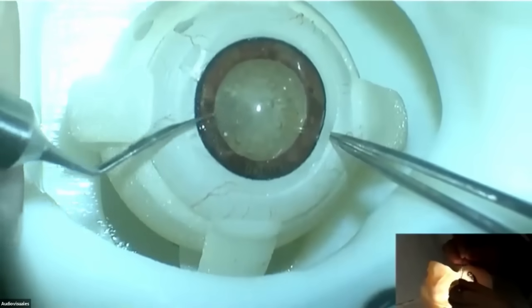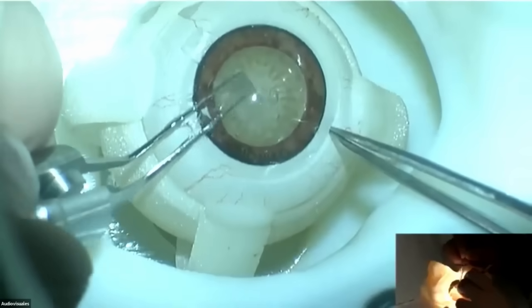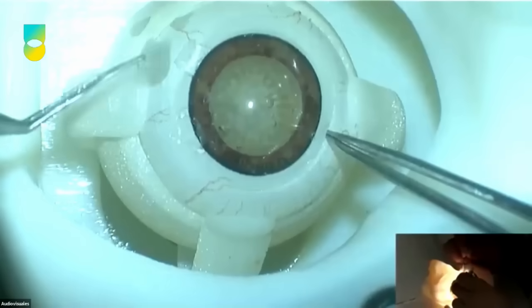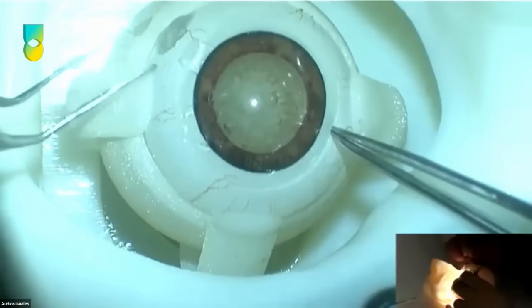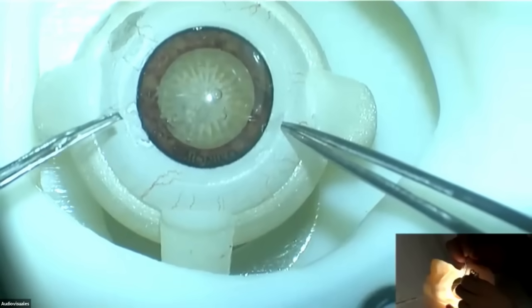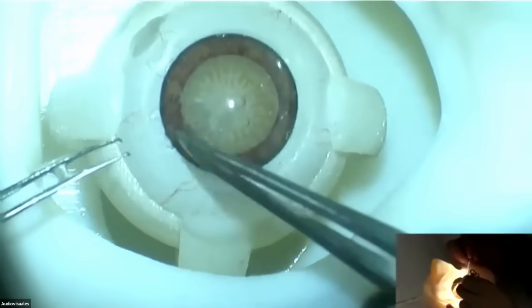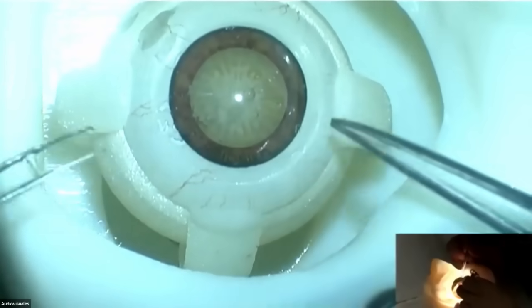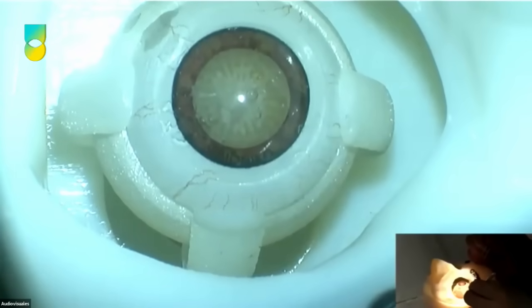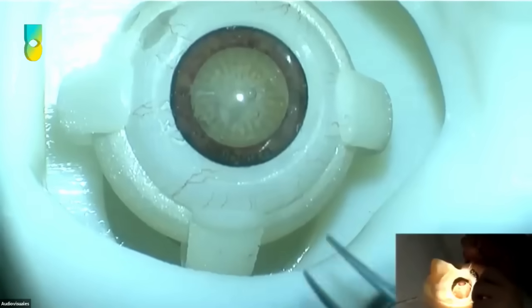I try to teach my students to always use both hands. Why? Because in the surgery, the way I do it, I always use two instruments to move the lens pieces, the cataract pieces inside the eye. So I try to tell them to stabilize the eye with a Sinskey hook or a chopper.